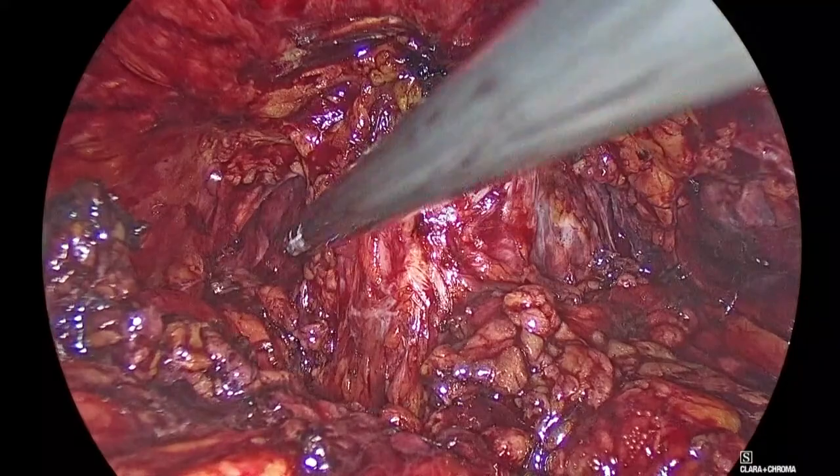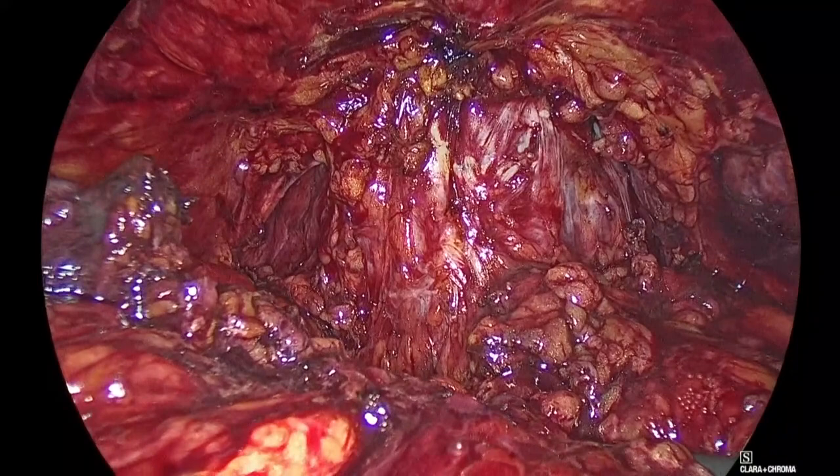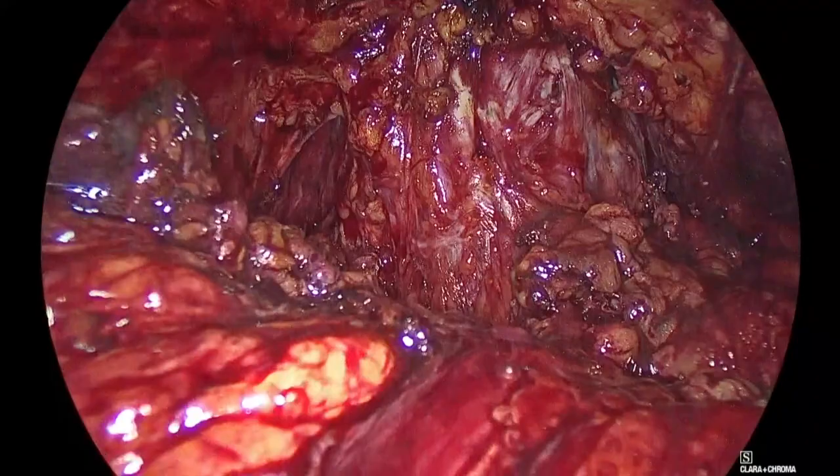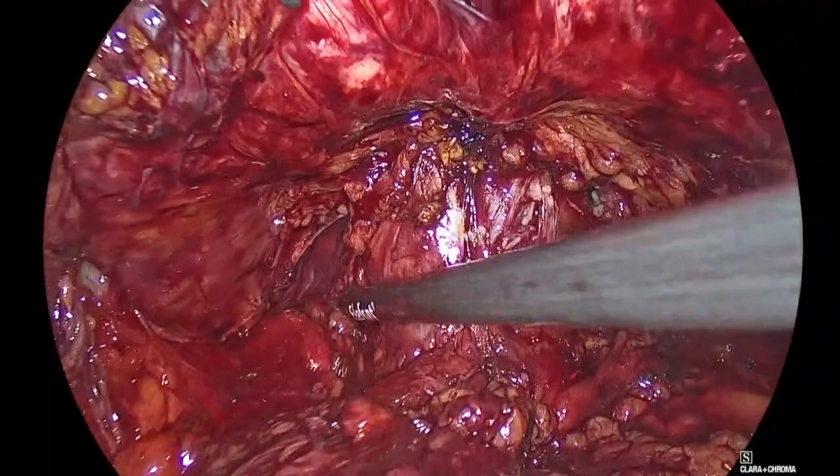So what I do now is I empty my balloon. I empty my balloon. Give me a grasper, please. I empty my balloon because you can't dissect nicely with a full balloon. Good. Harmonic and bipolar. And we go for the anterior bladder neck. So, Panagiotis, leave it for a second. Leave it. You see, we can't mobilize this more here. We also had a hernia here at the obturator fossa.